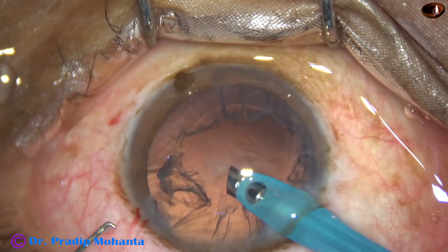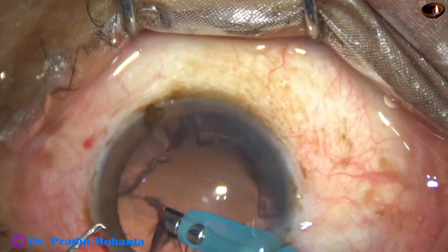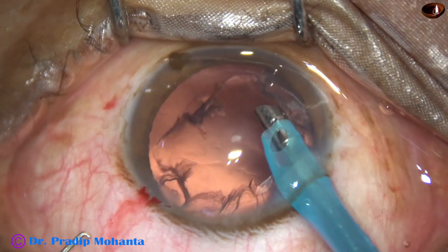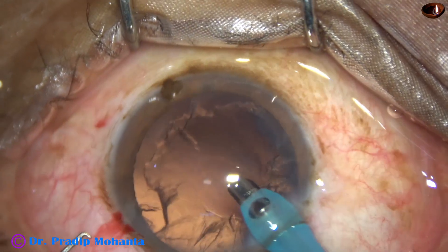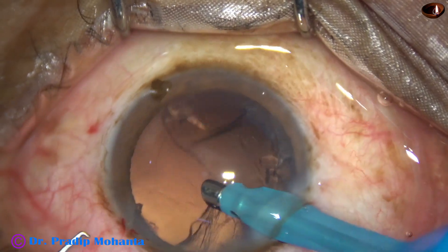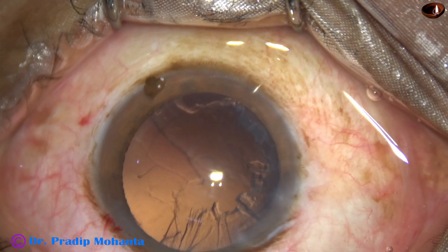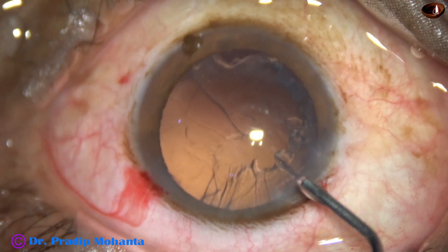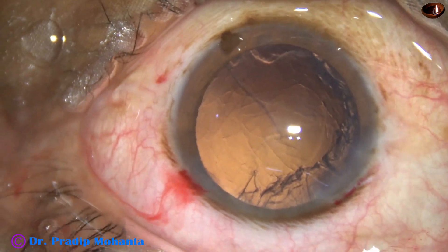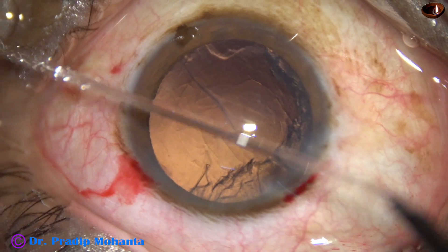Now I am in phaco 3 mode and trying to remove the cortex, but I found it not very safe, so I came out. I am now going to use a Simcoe cannula to remove the cortex.